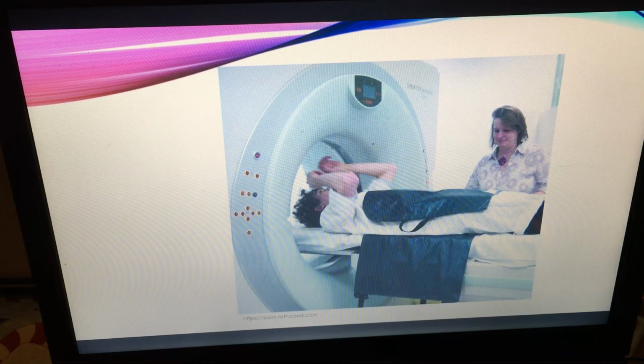Shielding is vital in reducing patient dose. Though there are many other techniques, the most effective would be to use as many as possible. If a facility does not offer bismuth shielding, then the CT tech should try their best to use out-of-field shielding.